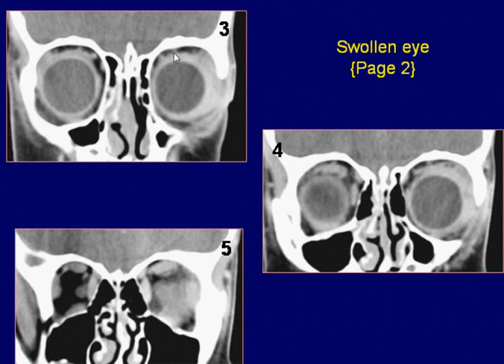Coronal post-contrast CT scans confirm the involvement of the anterior orbital soft tissues and anterior muscle cone. CT findings are consistent with orbital cellulitis.